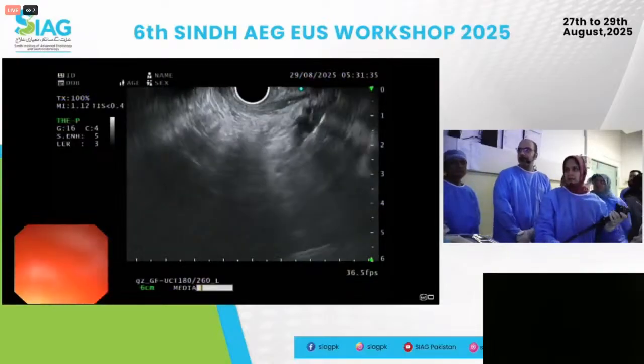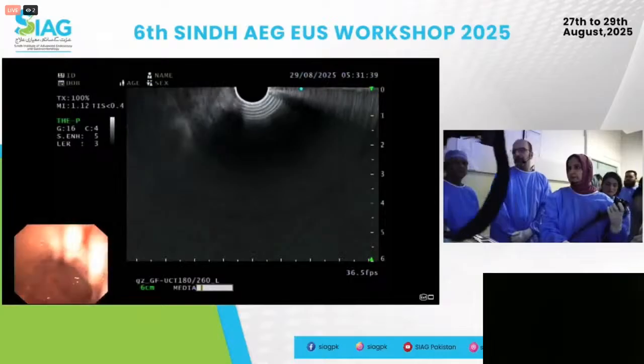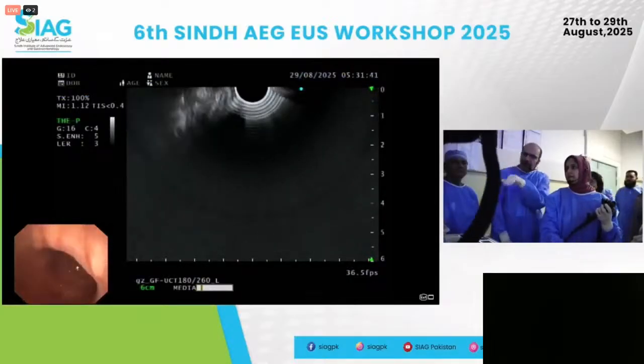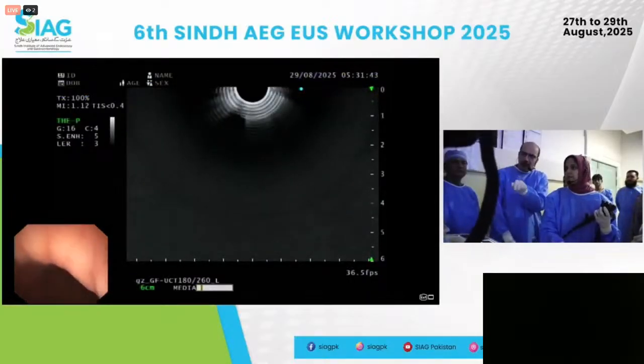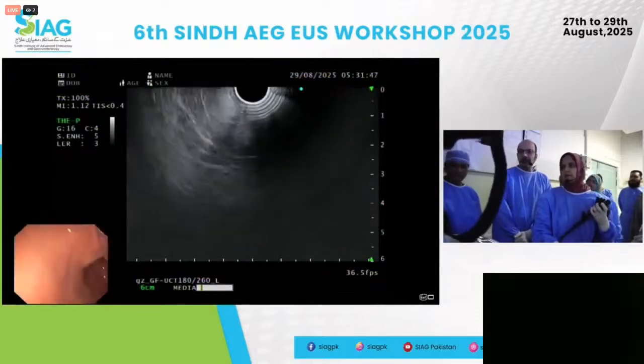Okay. So now, moving on to duodenum. Yes, go ahead and move on. I think you could see the duct. You could try and follow it to go further down towards the neck, but it's okay for now. In the interest of time, why don't we do the duodenal exam?